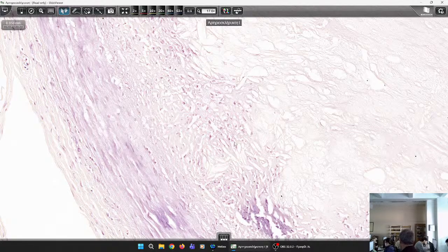Being phagocytes, the macrophages have enzymes which, when secreted, soften the plaque, and this is not a good sign because it might rupture. Of course, if the plaque is very hard, it's not always for good, but when it is softened by the enzymes of the macrophage, this may more easily lead to its rupture.